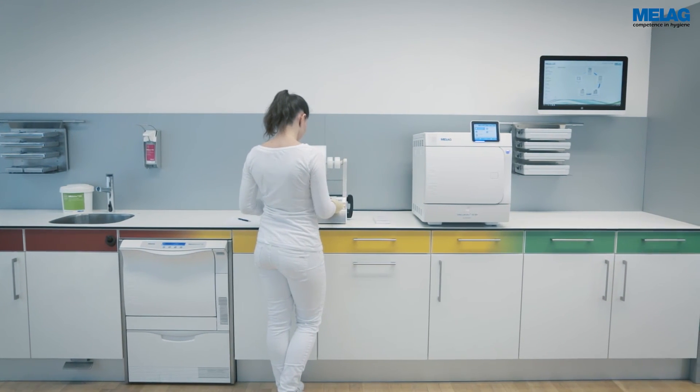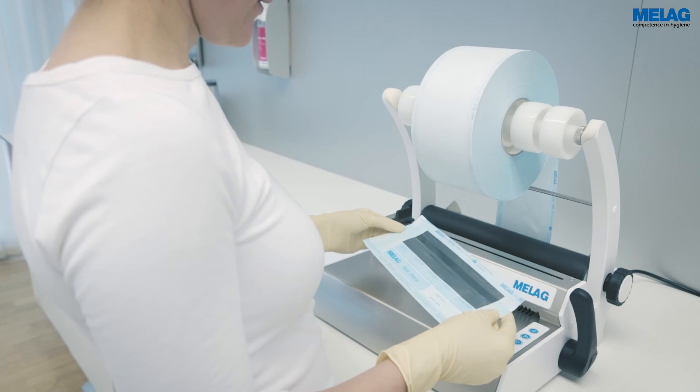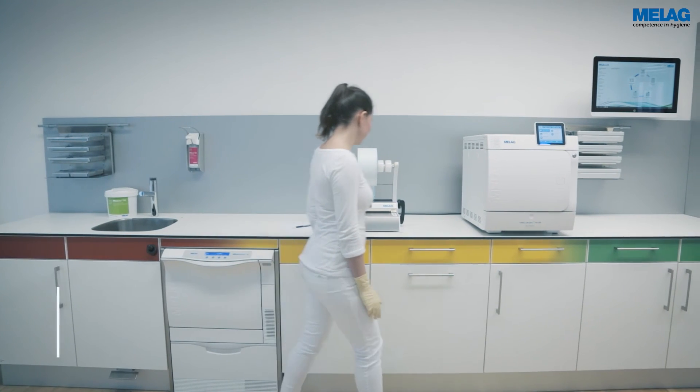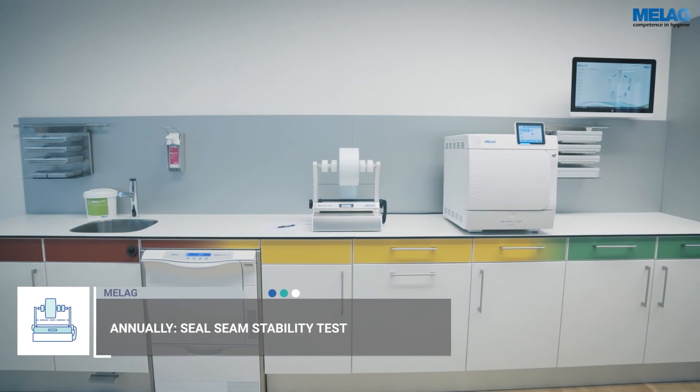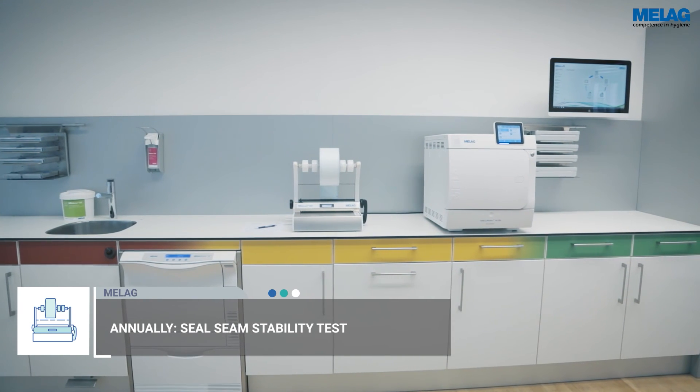The seal seam on the test field must be free of wrinkles and bubbles or any further irregularities. The routine checks are completed by the annual Seal Seam Stability Test. Comply with the instructions in the following video to perform the test.